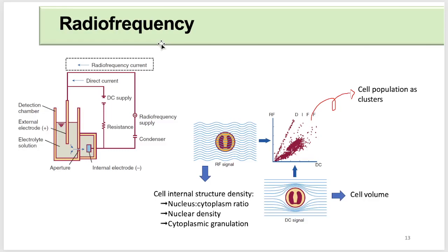Again, we discussed your low voltage direct current impedance or your electrical impedance as described a while ago that can be used now in conjunction with your radio frequency resistance. So again, dalawang factors. Ihahalo natin yung electrical impedance plus RF frequency.